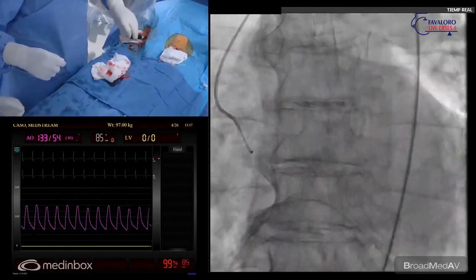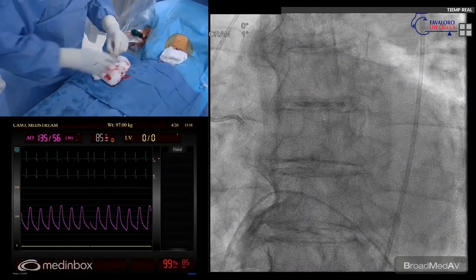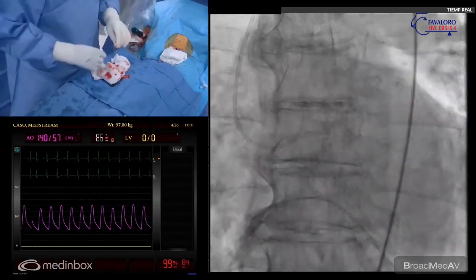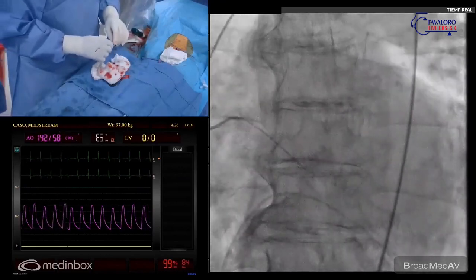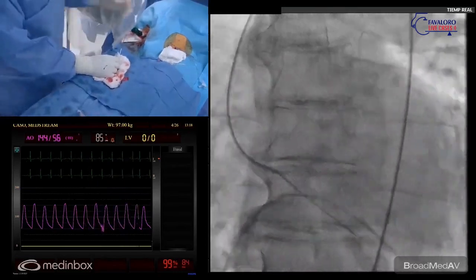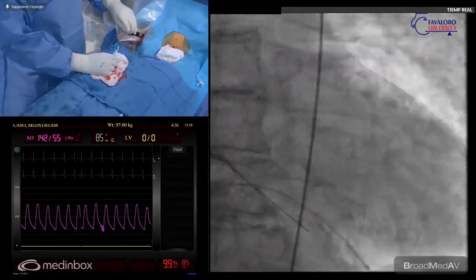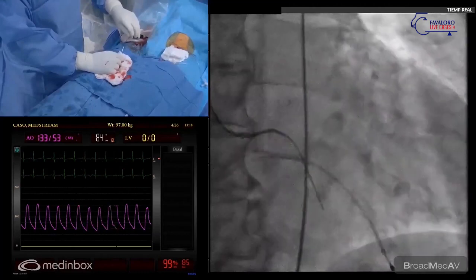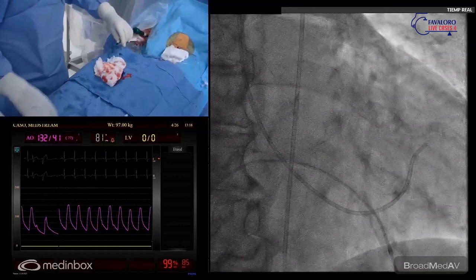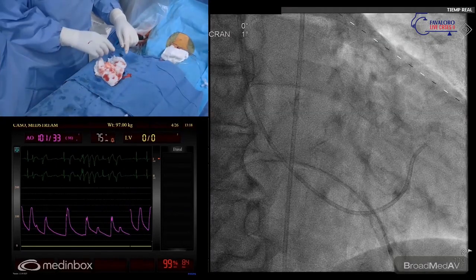So as we were waiting a little bit, we added some additional heparin. Many people are not doing the working projection with angio. But I think sometimes you have some discrepancy in between the right oblique. Here is where we have to take care. When the catheter jumps, if the wire is looped, it's okay. If the wire is not looped, we have to be careful. We are jumping against the wall.